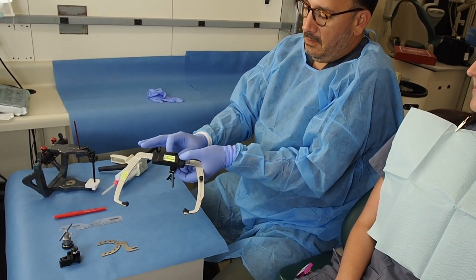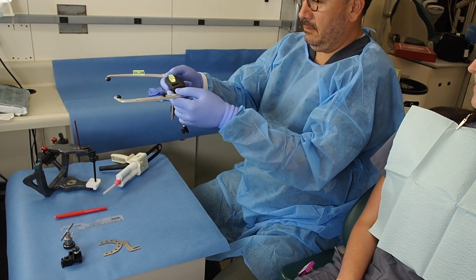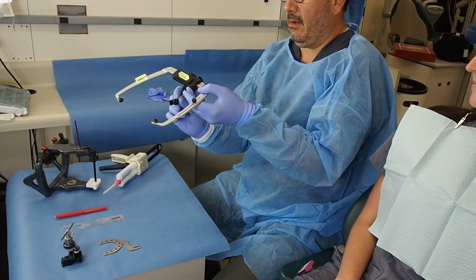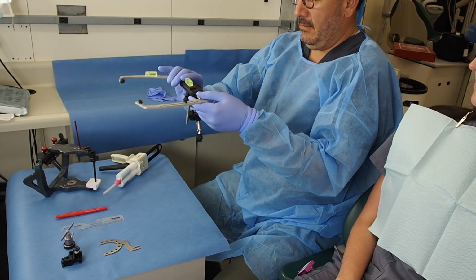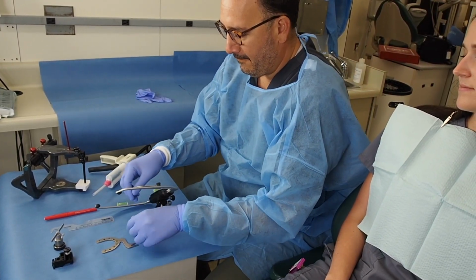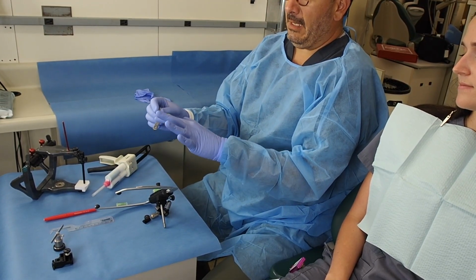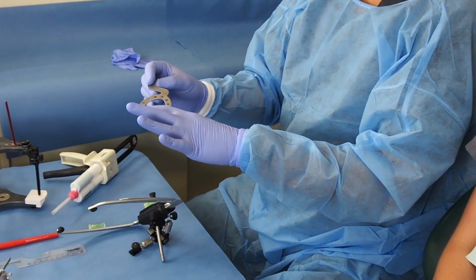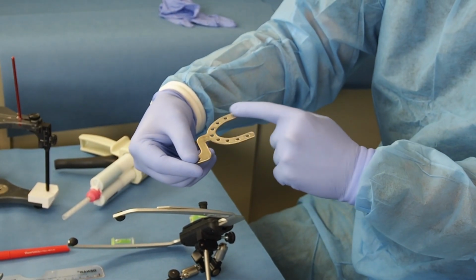Then put it back in. Now we have the articulated arm ready. Okay? On top of that, we will have the bite fork. Bite fork has a dull area and a shiny and round area. I like to use the shiny round area.